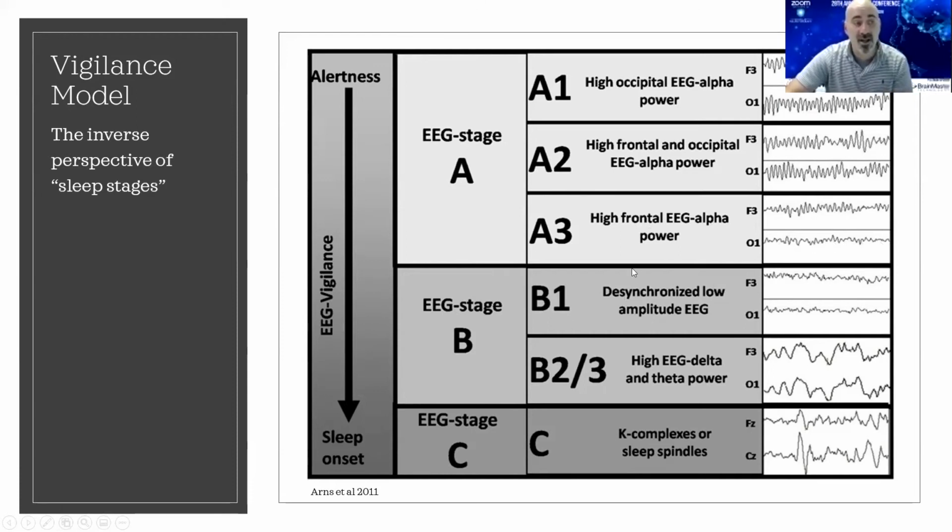B1 is a desynchronized low amplitude EEG, and we're going to look at this closer in just a moment. B2 and B3, we see the rise of excess theta and delta as the brain is moving closer and closer to sleep. And here in stage C, with the K complex, which actually comes from a specific wave that we see. If the person is really getting deep into drowsing and you knock on your desk, you'll see the elicitation of this particular wave seen here. And now we see the emergence of sleep spindles. And this is where, in fact, sleep onset really begins.